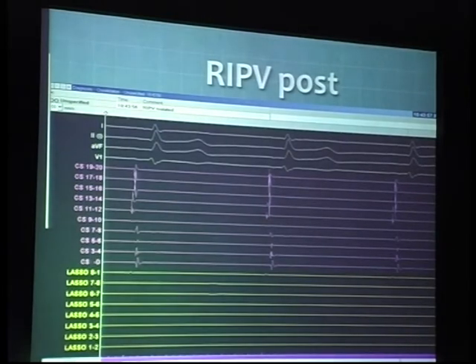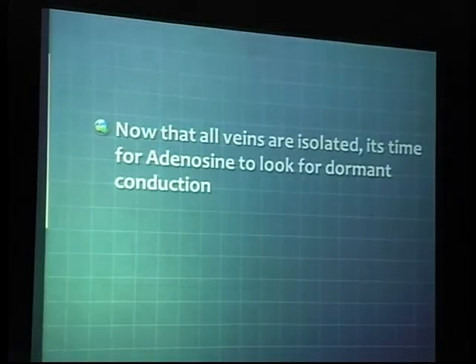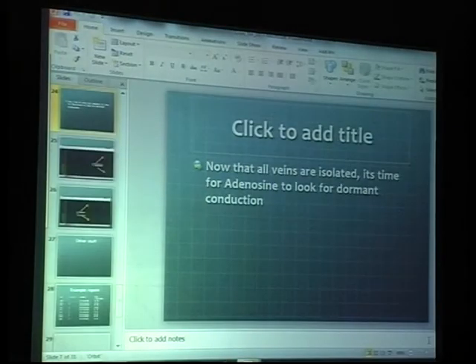This is the RIPV post-ablation. You pretty much see not much of any electrical activity there — both the entrance and exit blocks are demonstrated. In most of these cases, as everybody has started adapting using adenosine as one of the confirmatory tests to demonstrate dormant conduction, we also do that on a pretty routine basis.